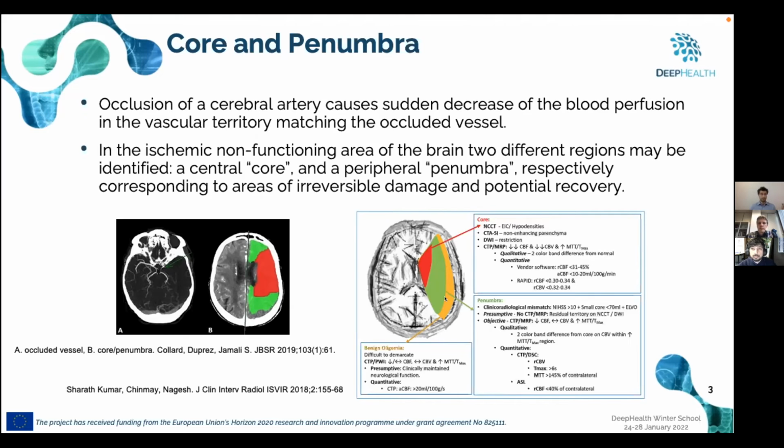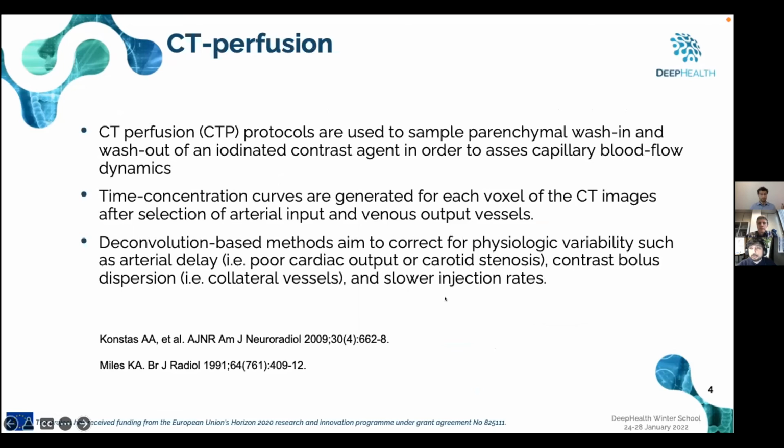So what is perfusion? Basically, we inject a bolus of iodine contrast, and we measure the wash-in, wash-out of this agent to assess the blood flow dynamics.